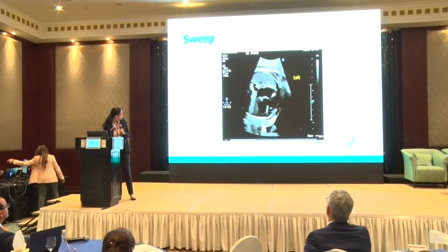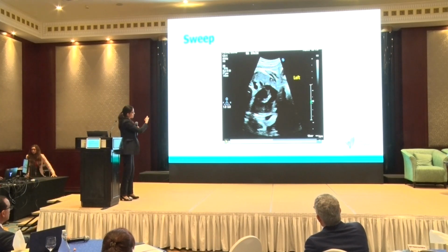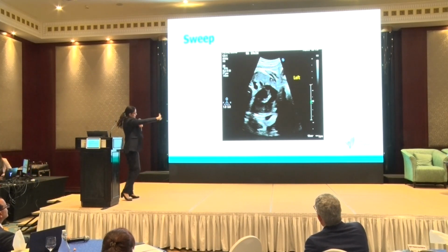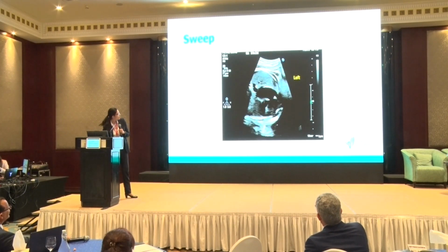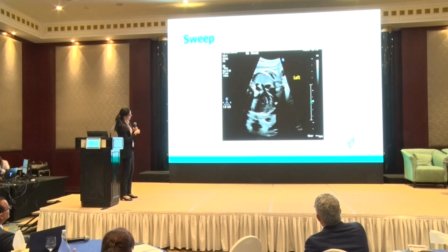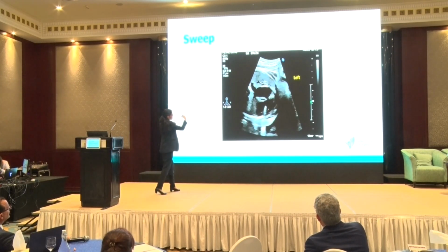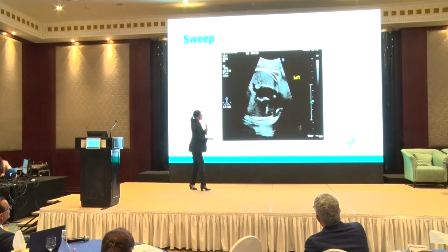I can run again. And then the first vessel appears. Yeah, so there's this vessel that is not branching, all towards the left. So at the moment we think it's likely to be... So not branching, and then we have this small vessel on the right side. But when you look at it, here it's branching. I'll freeze it.